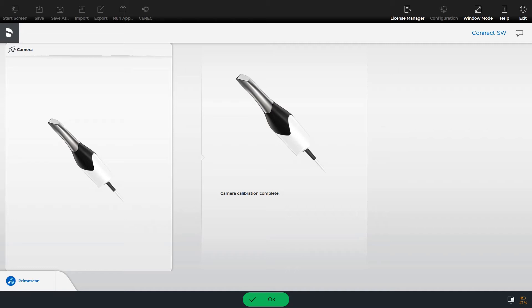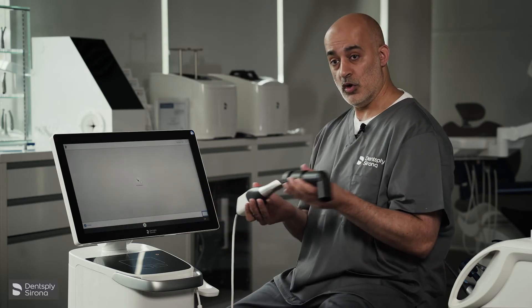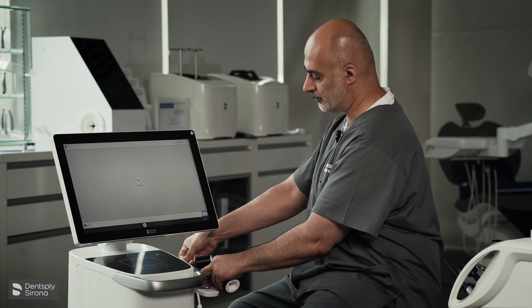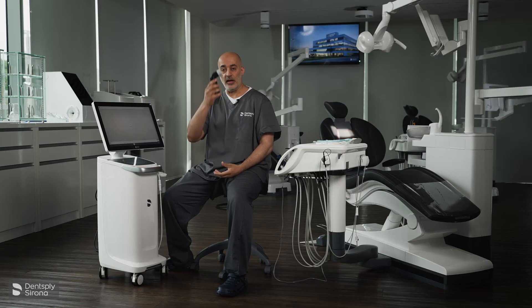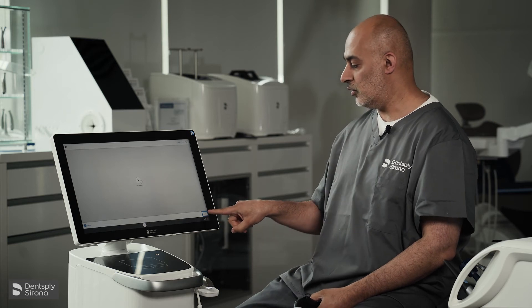Camera calibration is complete. You can select OK. You remove and disengage, then place your camera back carefully. You will now screw this clockwise. Place the lid back on and this goes back in your kit. Camera calibration is now complete. You return to the home screen.